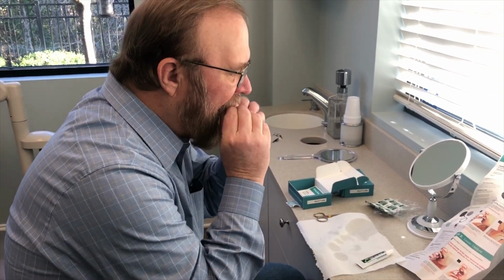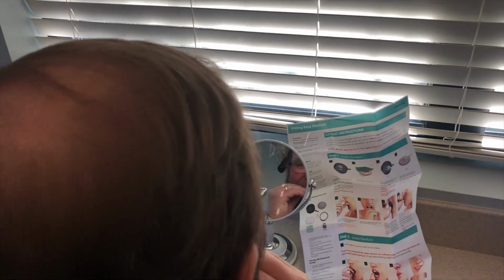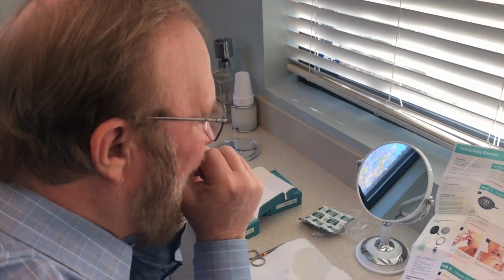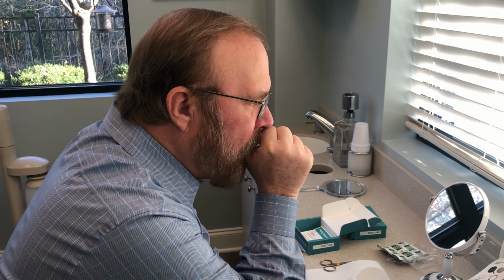You put it in. You'll probably want to use both hands to manipulate, and you've got your mirror here too. Based off the instructions, you want to line up the bite first, and then get the roof of your mouth, extend it back, and do the thumb sucking technique. It's really like sucking your thumb, which helps to form a seal back there. Do you feel it getting tighter against the roof of your mouth? Okay. Then push around the sides, trying to capture all the undercuts and all those ridges that you have around the cheeks up top.